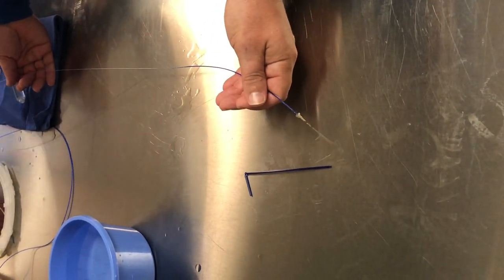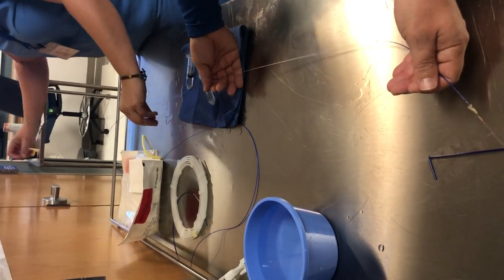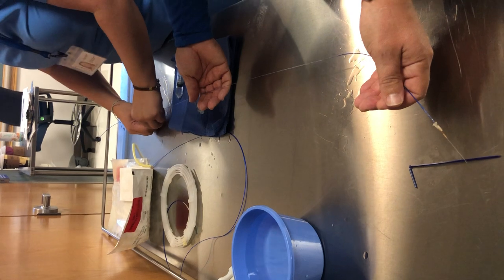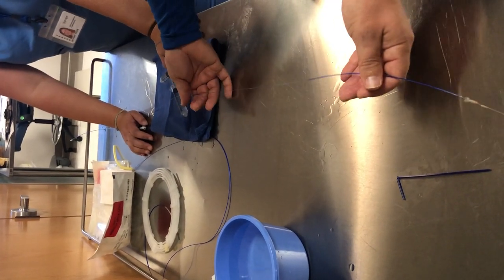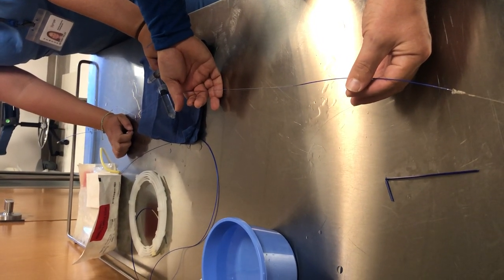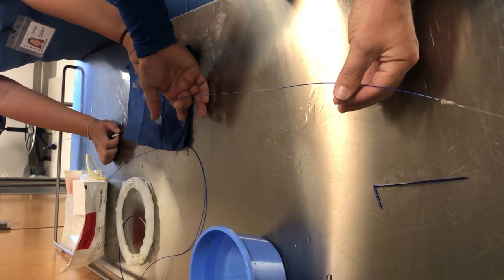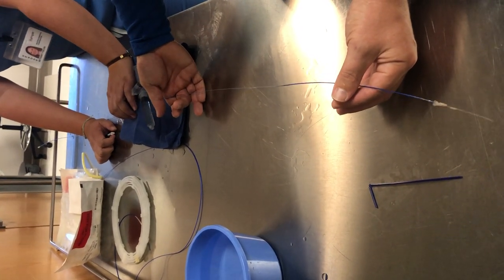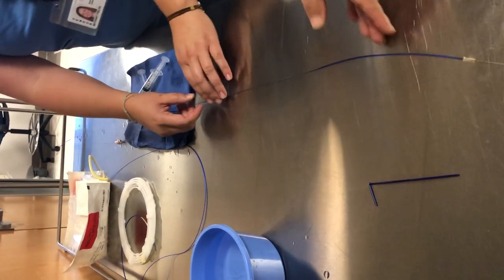Again, use the torque device. The movement is a push-pull: you're going to pull on the filter wire so you're pulling it into the sheath, while also gently advancing the retrieval sheath at the same time.